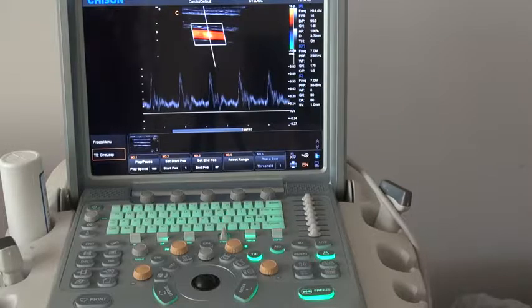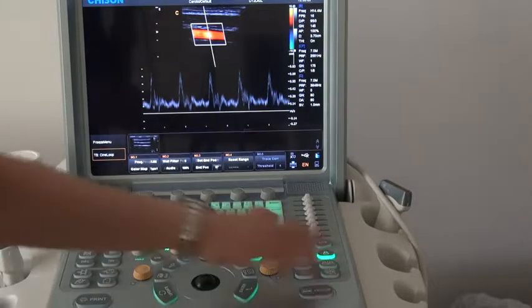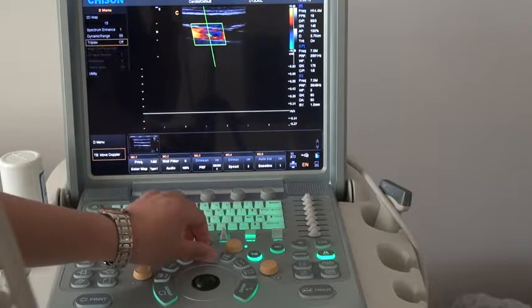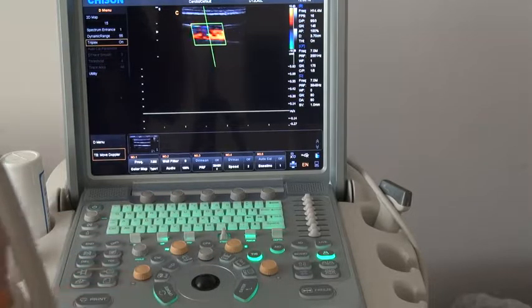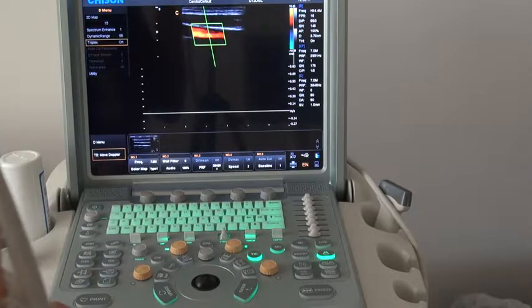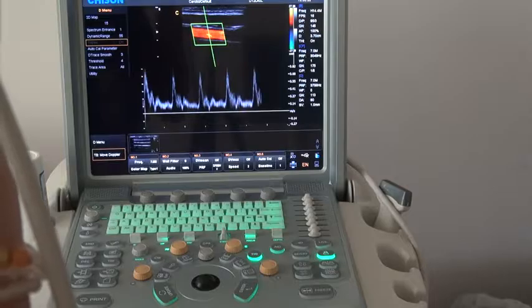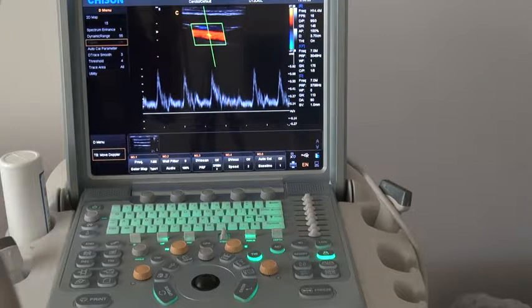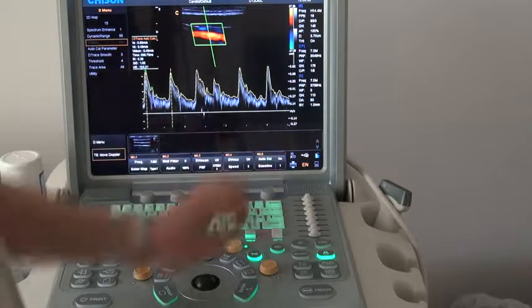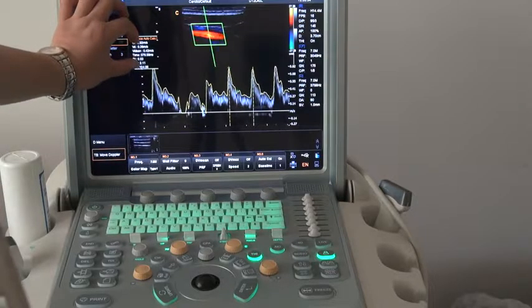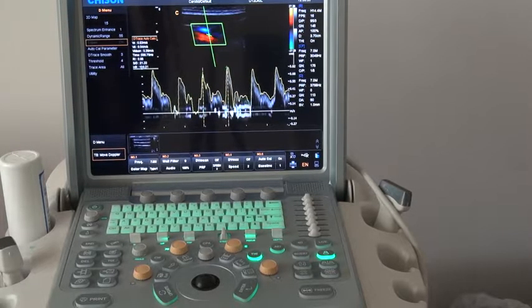After that, I will show you how to open some other features. In D mode, press the menu key and you will find the Triplex option — press it to open it. Then press the update key. It has a high frame rate, and you can press auto calculation. You will find this is our Triplex function. It will get real-time results on the screen, which is very convenient for the doctor's usage.